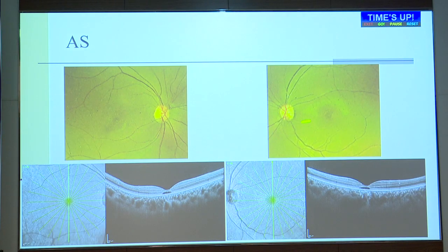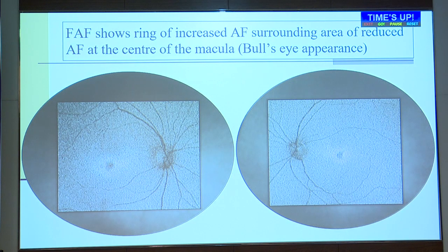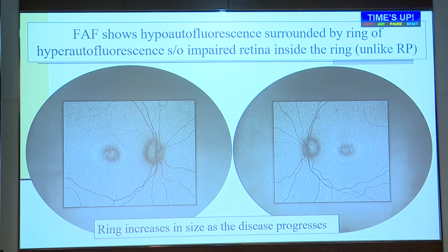This is a patient, a 28-year-old lady who complained of decrease in color vision and day blindness kind of thing. And this was the OCT image. And the ultra-wide field showed us a bullseye maculopathy, suggestive of cone dystrophy. Some other patients of bullseye maculopathy.